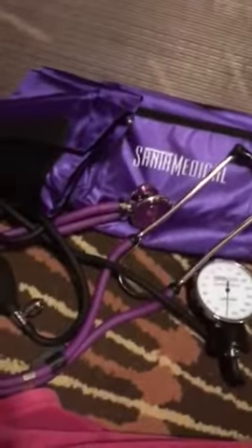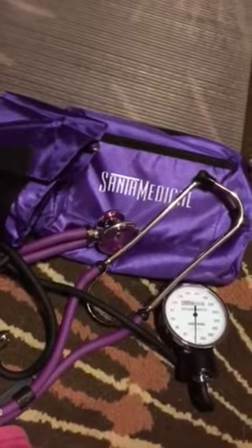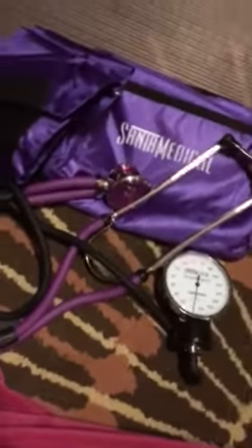I have combat life-saving skills, and there have been times at home where I knew that I could monitor my child's vitals but didn't have the right tools to do so. Now I do.